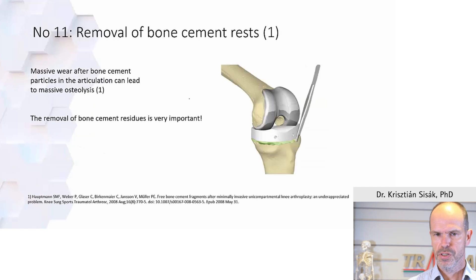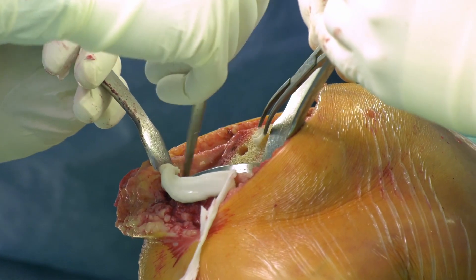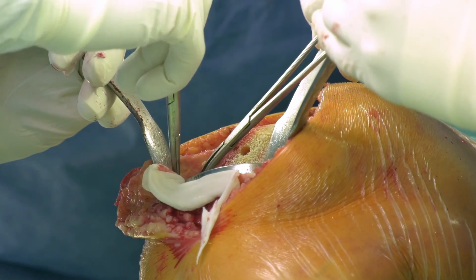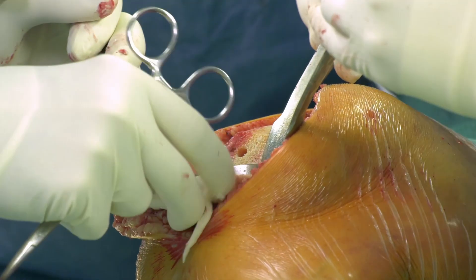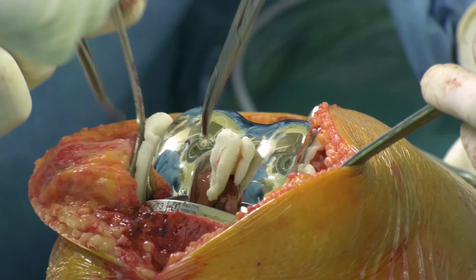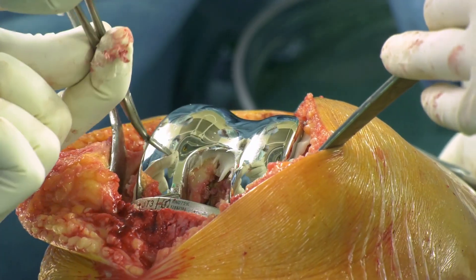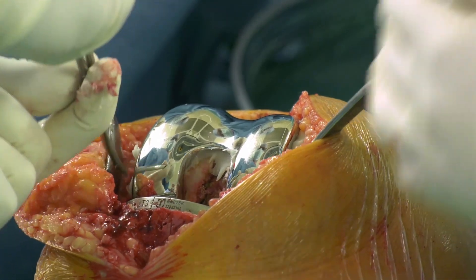To remove excess bone cement, use single clear movements and create a clean interface. Do not penetrate the interface between cement, bone, and implant. Use a single clear movement for removal and do not remove any cement from underneath the implants. Ideally do this only once or as few times as possible. That was the summary of the cementation technique.